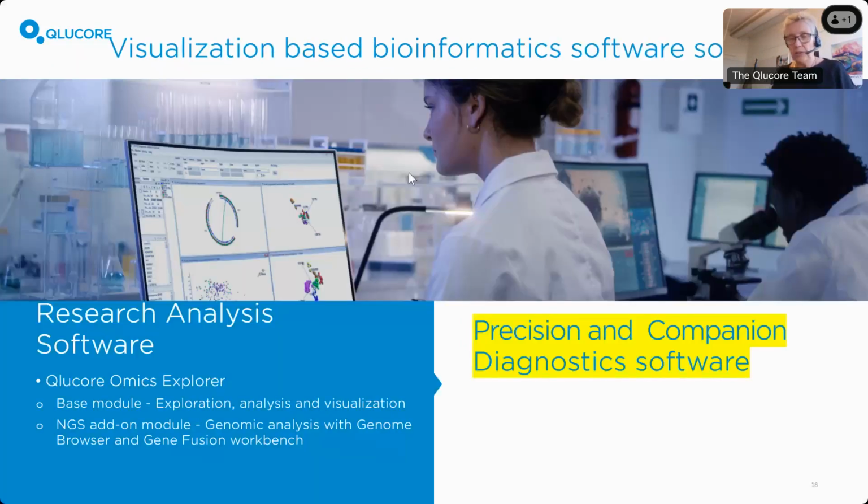So we are actually now in Qlucore working with a new product line where we use the classification features that we have developed for Qlucore Omics Explorer in new software that will be used for diagnostics, to help doctors establish which precision or companion diagnostics, which drug a patient should use and what subtype of disease the patient suffers from.